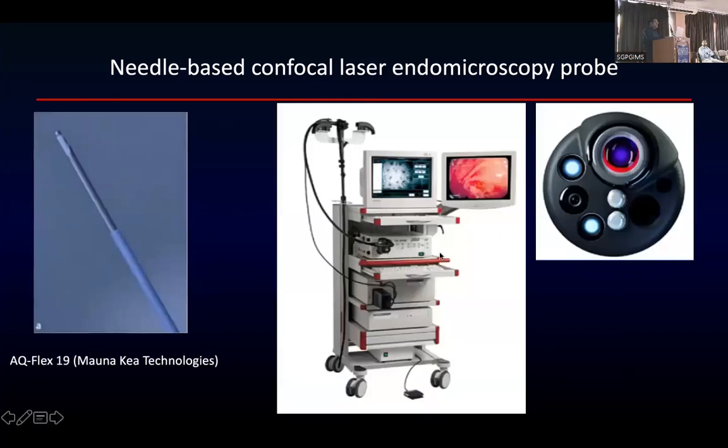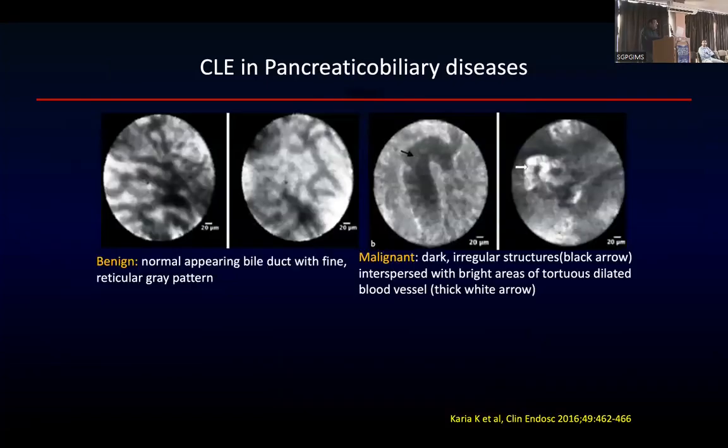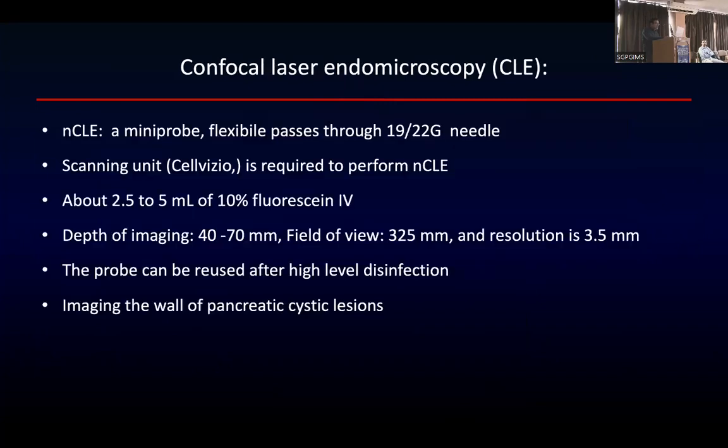Obviously this is an expensive Cellvizio device which you need to have if you want to use this confocal laser endomicroscopy probe. This is the probe, which will go through the 19 gauge FNA needle. These are the images that you get. So primarily what you are doing is competing with the pathologist by having a real in vivo histology in place. This is the advantage of confocal laser endomicroscopy.